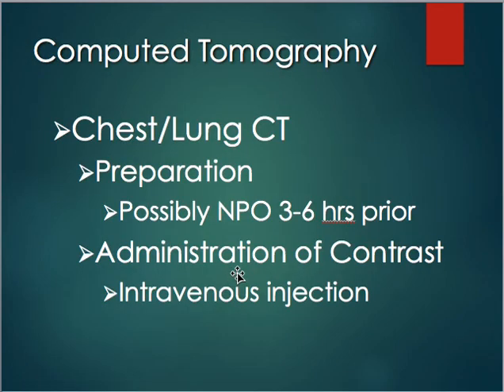So moving on to chest CTs. The prep for a chest CT is NPO for 3 to 6 hours prior. We're going to administer contrast again through an IV. Anytime we're giving IV contrast, we want to make sure that they're NPO for 3 to 6 hours to avoid nausea or the possibility of vomiting.